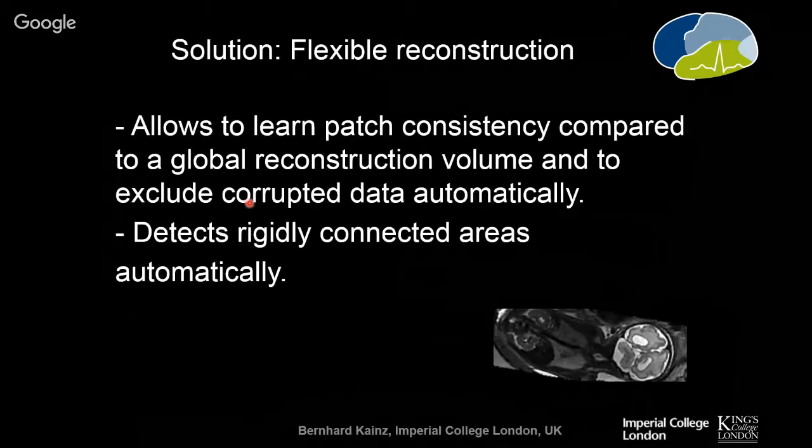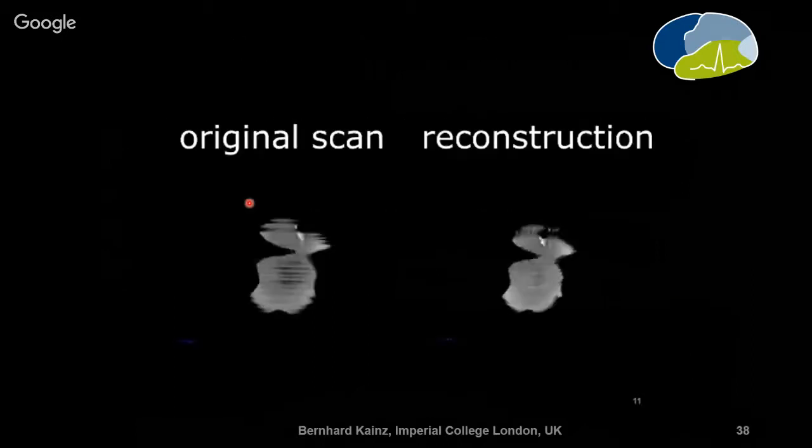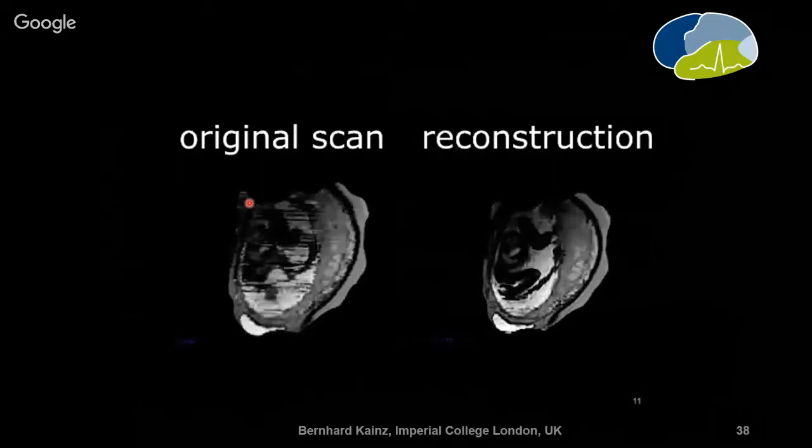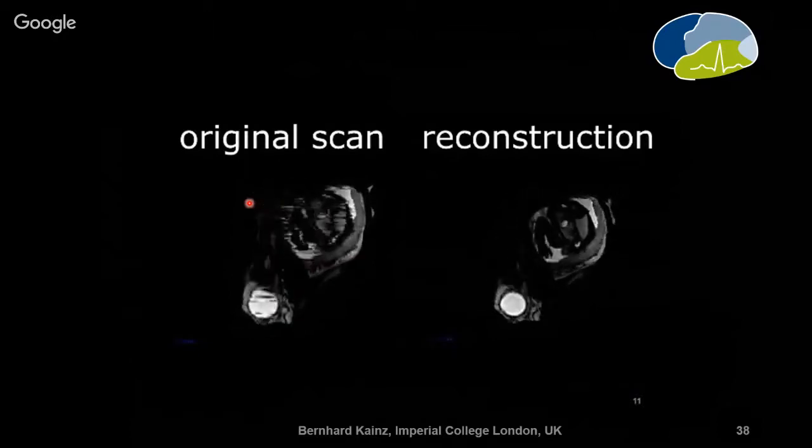So if we keep track of the probabilities from our M-estimator, we can already derive a rough estimate for which areas would be relevant for bulk motion, and then we could use this, of course, to do classical slice-to-volume registration or refinement to get more context for the registration, so a more structurally accurate reconstruction. And well, this approach is quite applicable. So as you can imagine, it's even harder to do it for twins.